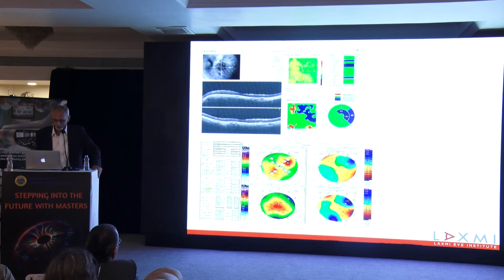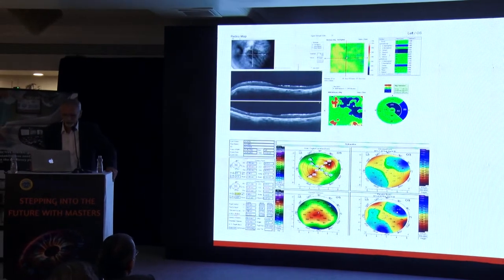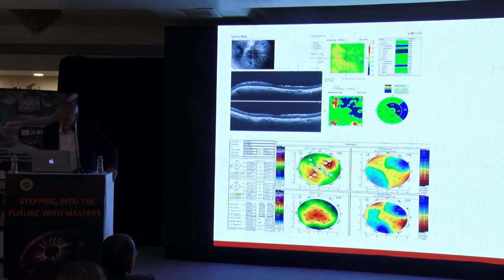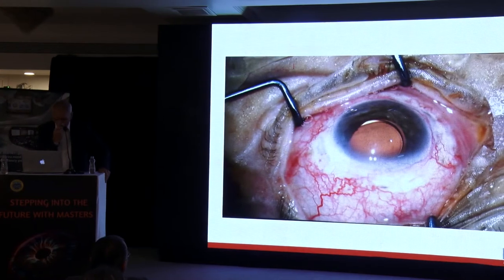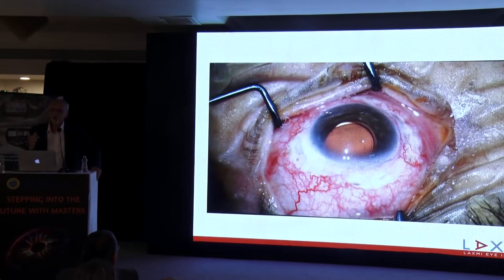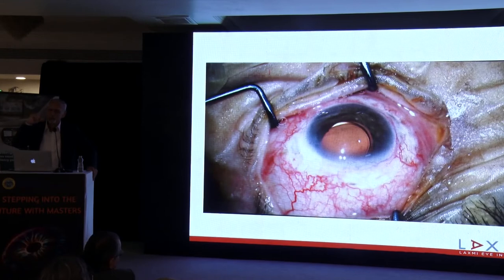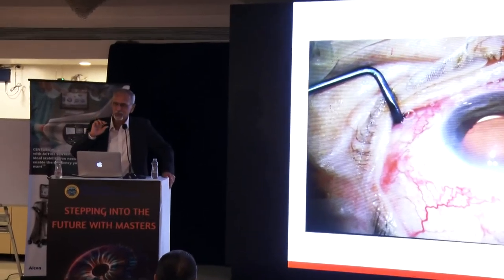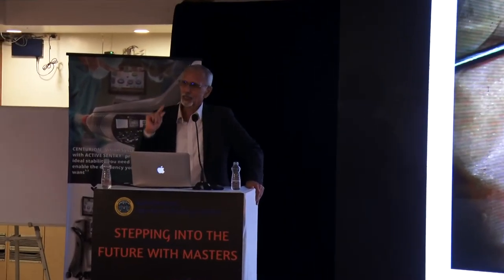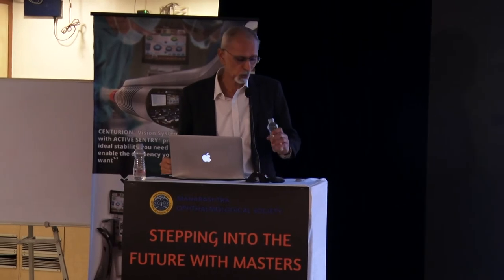The macula was okay. The OCT did show a big cylinder, but there was nothing much that I was able to do for that cylinder. And looking at this scleral situation, to me the most pressing thing was to get this lens out as early as possible, because every time the patient would move her eye up and down, the haptic would come out and go in. You could see it travel. It would come out, it would go in, only the tip was left behind. So that means it was a time bomb. Any time, the infection could go in.